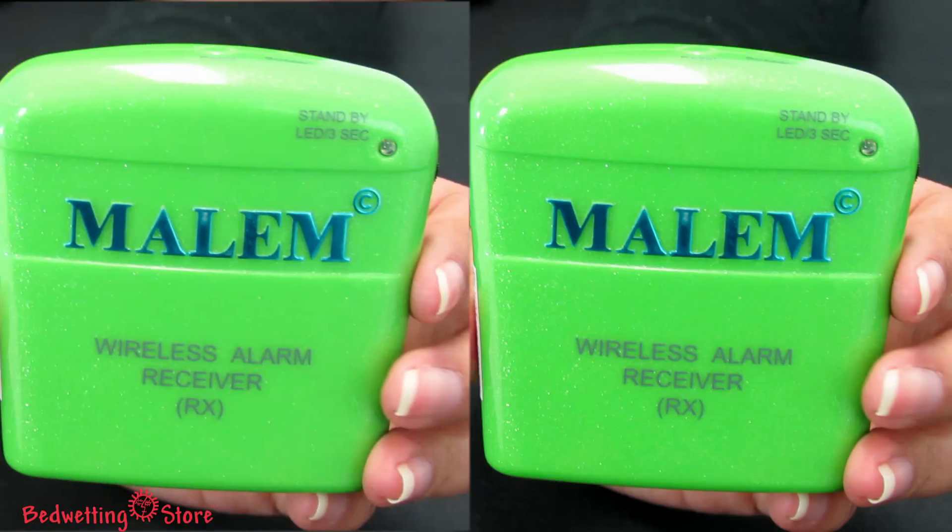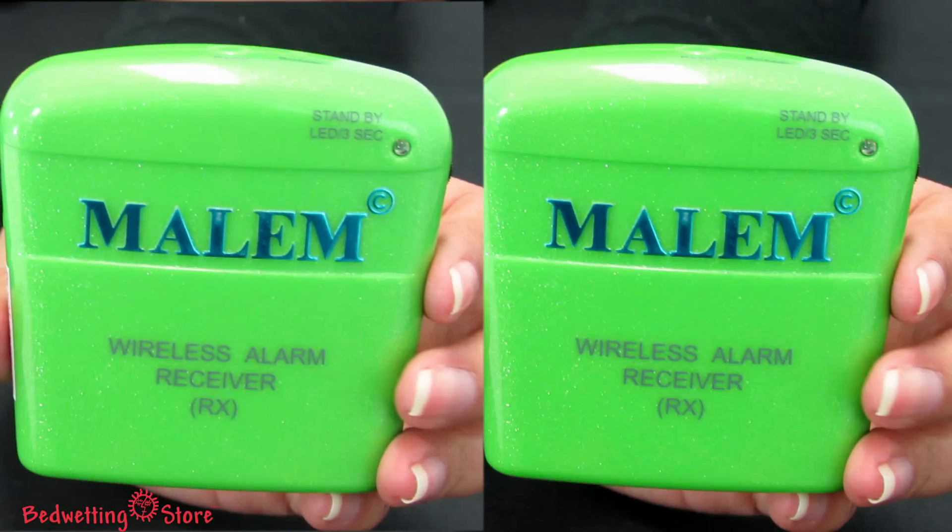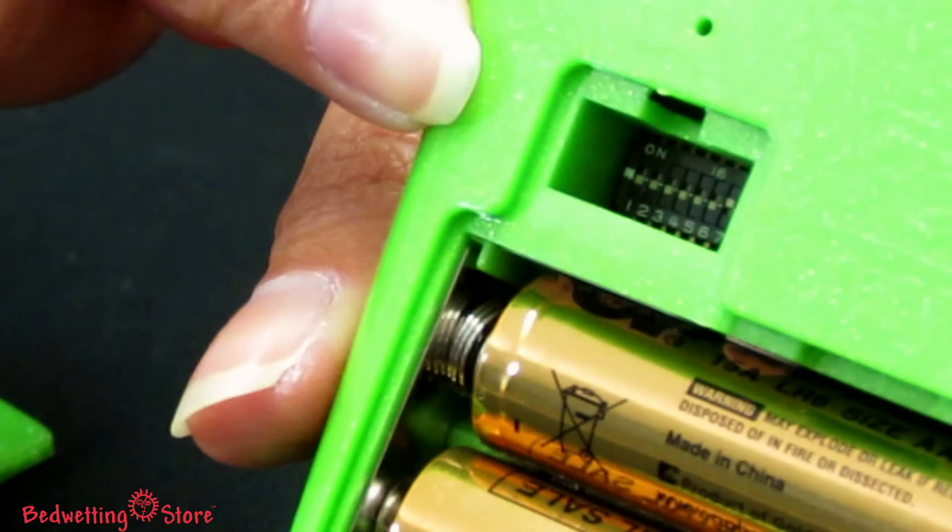You can order the Malem wireless with one receiver or two — one for your child's room and one for yours. We recommend dual receivers for parents who sleep far from their child. You can select one of eight different tones or let it randomly play the different tones.